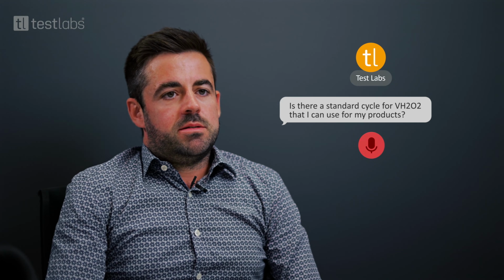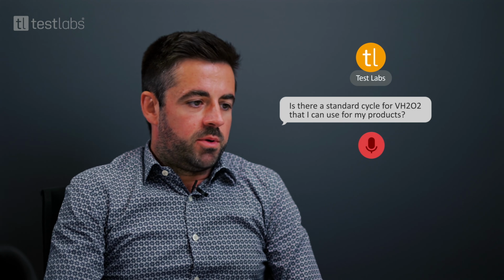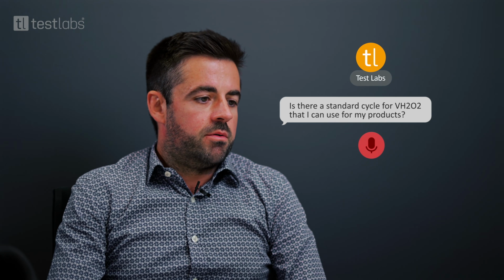Is there a standard cycle for VH2O2 that I can use for my products? It really depends on your application and your product. If your goal is to sterilize a very difficult product which has microfluidic channels and needs a lot of diffusion time, you would definitely need a longer diffusion time.